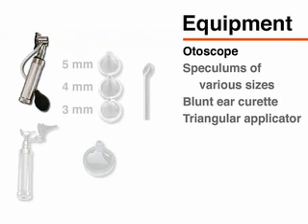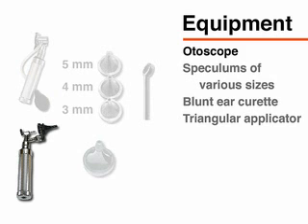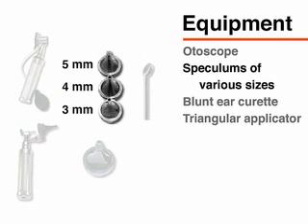For pneumatic otoscopy, you will need an otoscope with a diagnostic head that has an attached rubber bulb and a movable lens. Cerumen removal is most readily accomplished using an otoscope with a surgical head, but a diagnostic head also may be used. You should use the largest otoscopic speculum that fits comfortably into the external auditory canal. For very large canals, soft-tip speculums may be needed.